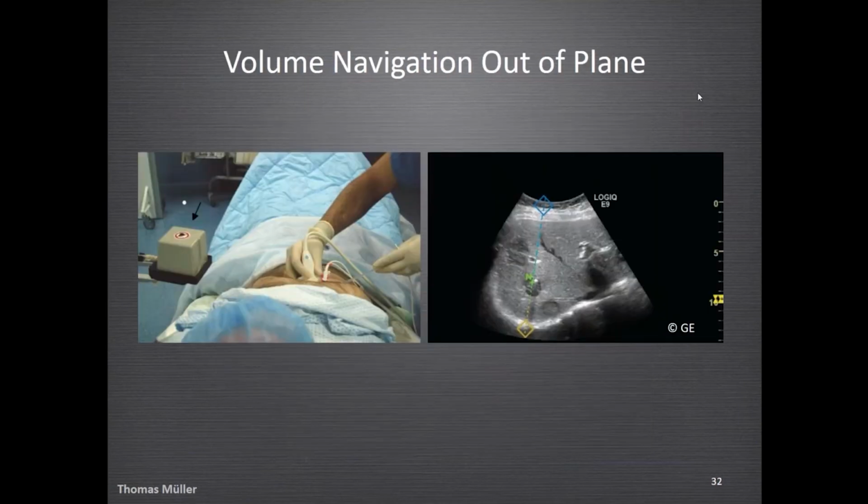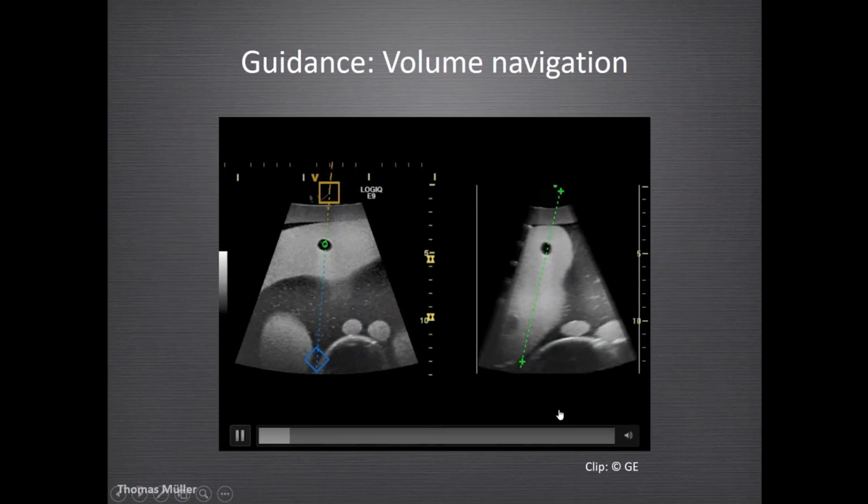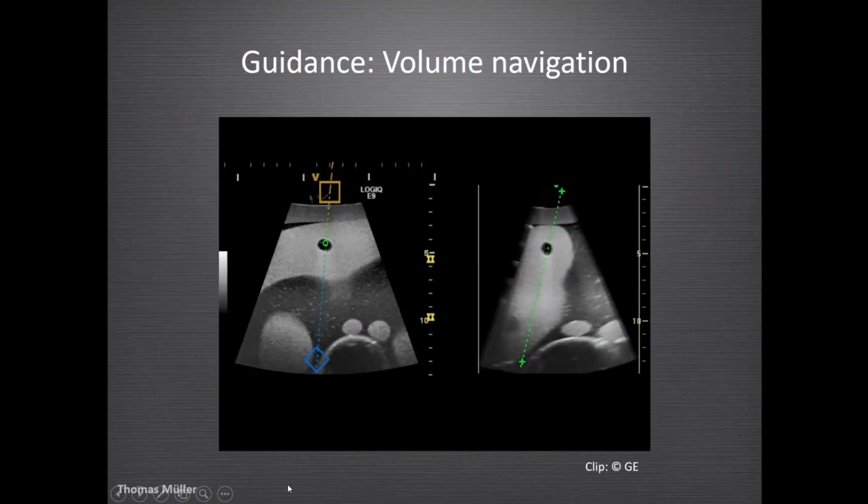We have a volume navigation out of plane. If you have volume navigation here, that little box on the left side, the GPS signal, shows you where your needle tip is, and you can even do it out of plane.